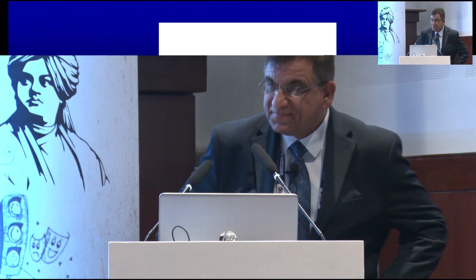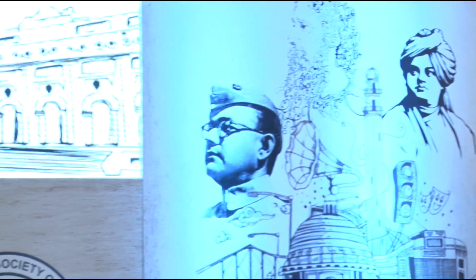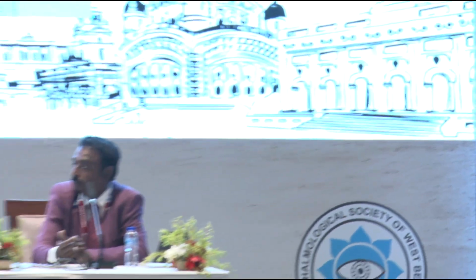Thank you for this talk and bringing up this topic. Nowadays, we have genetic testing and even gene therapies coming in, so it is extremely important to diagnose correctly before you go for genetic testing. And when you have a condition like the fundus you showed, with annular pigmentary disturbance, it's very important that you diagnose whether it's enhanced S-cone syndrome or a rod-cone dystrophy. Unless we get a good quality ERG, we cannot rule that out.